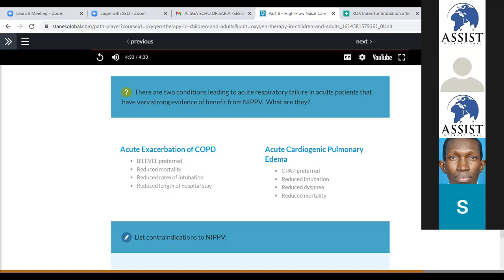And maybe it seems like he can end up needing intubation, or maybe if you want to try to avoid intubation, you could use something intermediate, which is our non-invasive ventilation. So this is applied to reduce the work of breathing, and also you can use it to avoid sometimes ending up in invasive ventilation through intubation. So those are more exemplified as we can see them there.